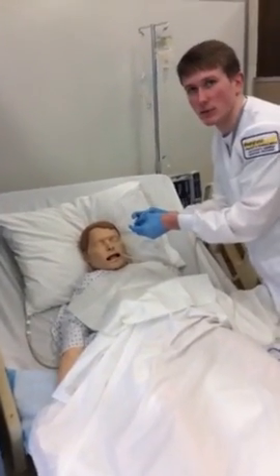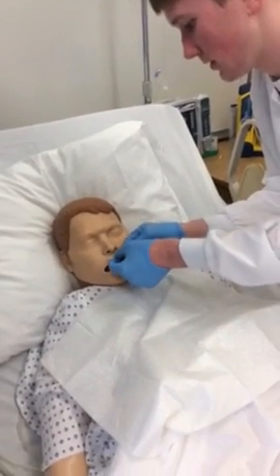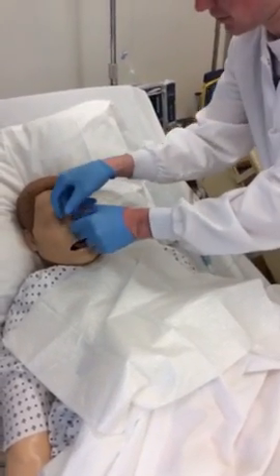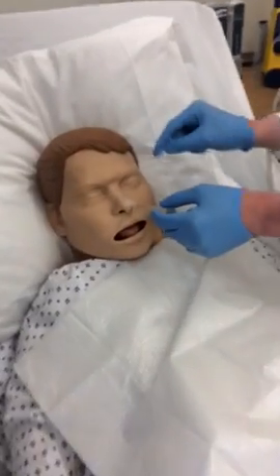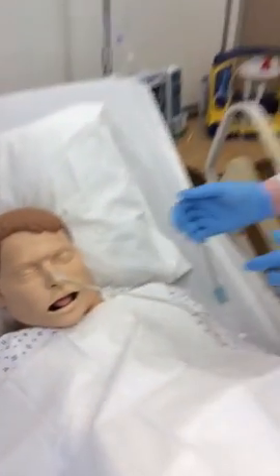Zoom in a little bit, come in a little bit. Get my tape under the nares, cross it over so it's secured on the nose. Zoom in on that a little bit. So just cross it over underneath. Okay, you can come back out now.